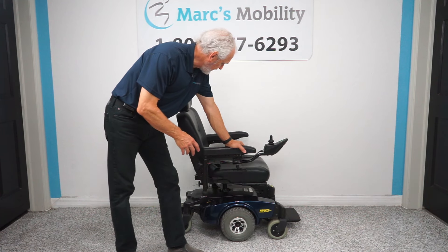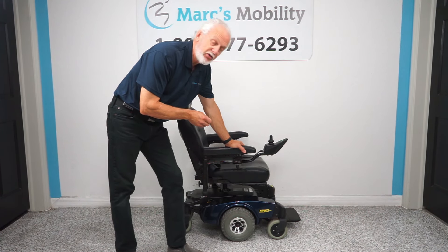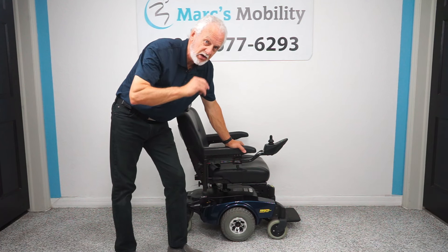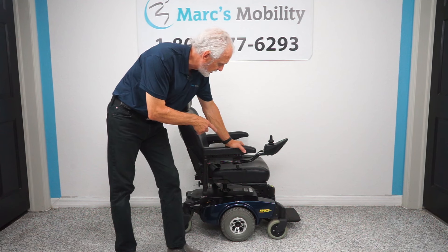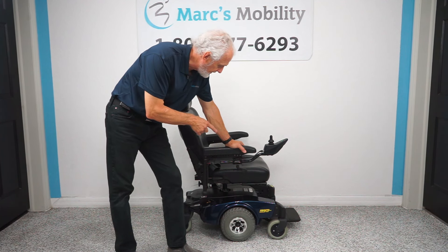Good morning, this is Mark with Mark's Mobility. We have a power chair — a Pronto M51. A lot of you out there are familiar with this one. As soon as you see this, you're probably going to be calling me. This is an oldie but goodie.